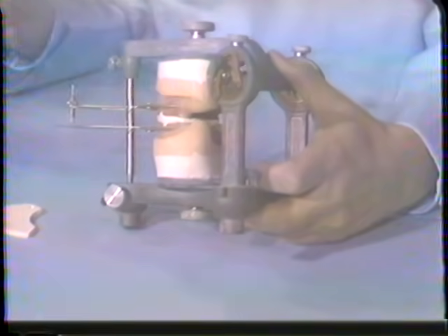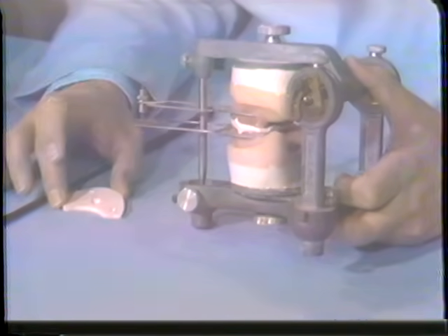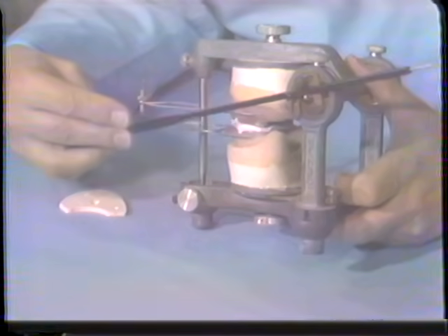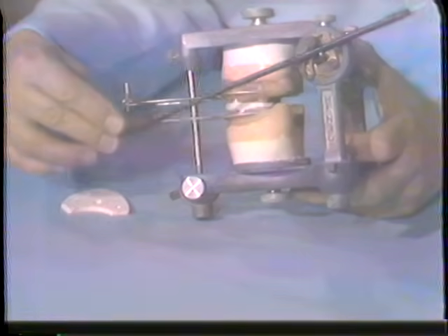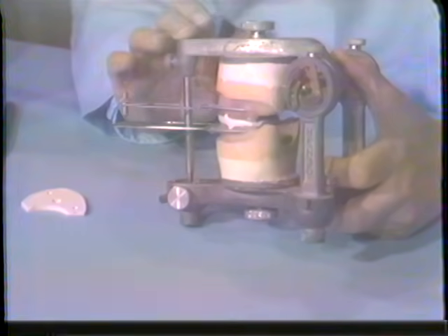All right? Now, if we want more information from the patient, we might make a centric relation record and also a protrusive record on the patient. Now we have two positions that we recorded. The protrusive, of course, we use to set the condylar inclination of the instrument. Now, beyond this one setting that this instrument is capable of accepting, everything is on a simulated basis.